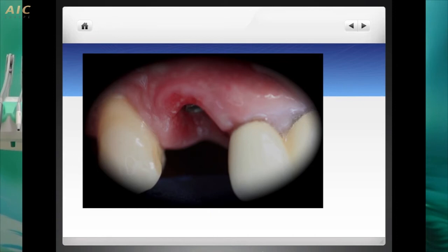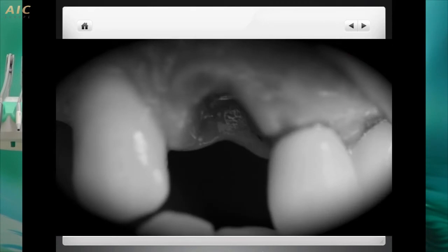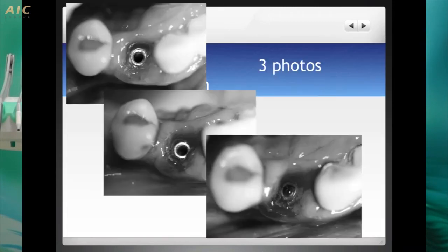And here, when I show you, this is the best result that you want to have. But if you take 3 different pictures, and you only wait between them, you take one picture and then wait 30 seconds and take another one, you'll see what's happening to the gums: they are going to do a closure.